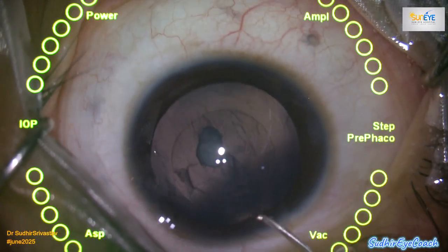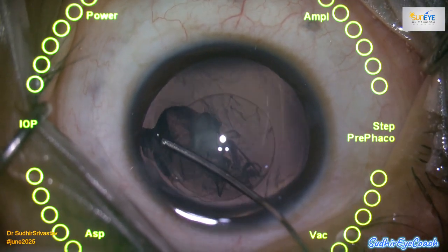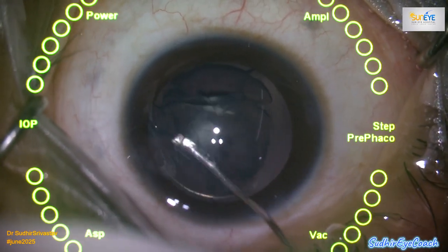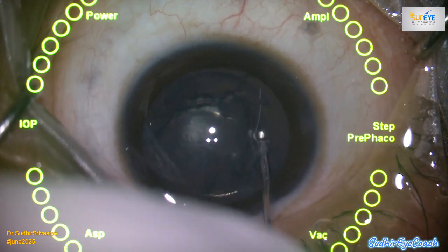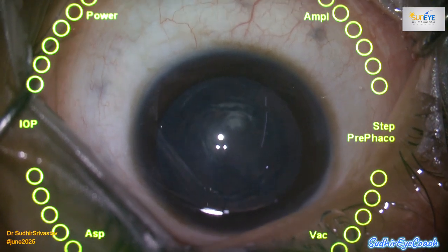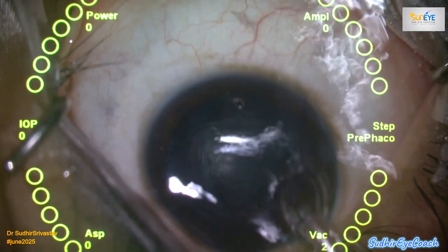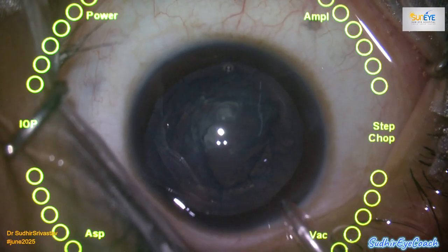During the polishing step, a small posterior capsular rent developed. This can be especially challenging when you are implanting a toric intraocular lens, because any extension of the rent can affect the IOL centration and stability. Fortunately, in this case, the rent was small and localized, and we managed it with viscoelastics and controlled anterior chamber pressure. These two factors played a significant and critical role in preventing extension of the tear, and we were able to safely implant the toric IOL in the bag with good centration and stability.